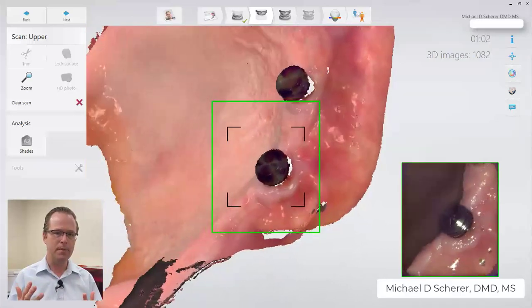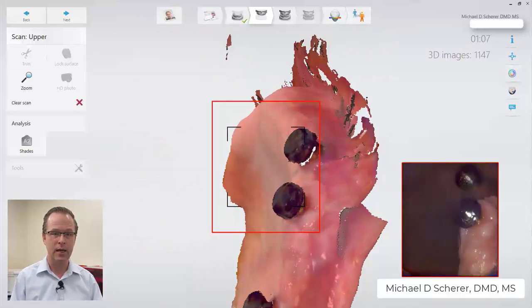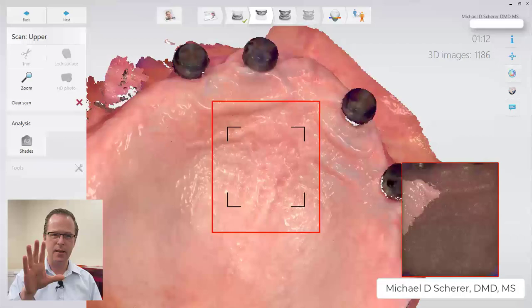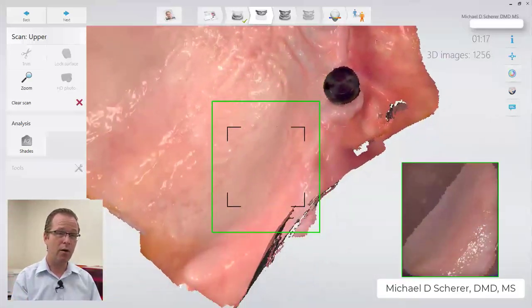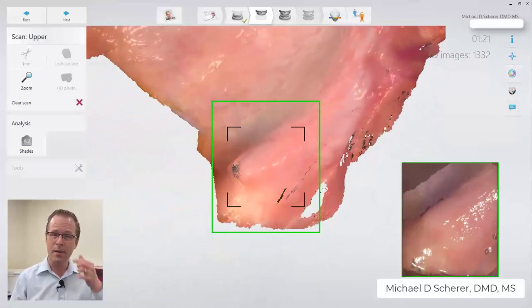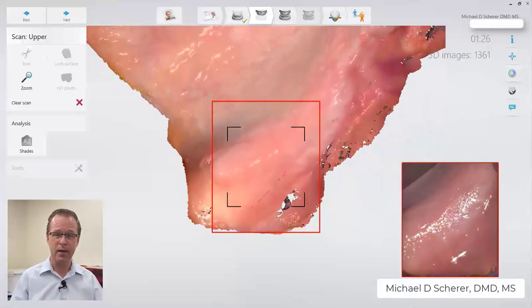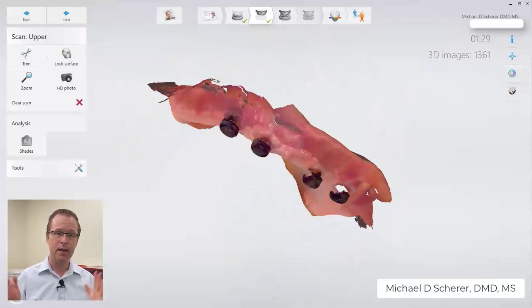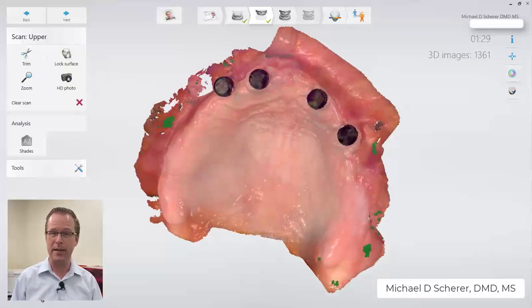We've now captured pretty much everything of the edentulous ridge and the vestibular area in the anterior. I'm going to go back and touch up, and if I ever get lost I go back to the pre-maxilla where I first started. Then I'll go to the posterior aspect, which is oftentimes one of the more difficult parts to detail and pick up — because I have to shift my hands and move around, which causes the vestibule to move a little bit. Overall, we've done a pretty good job scanning the entire maxillary ridge. Now we can go back in and pick up the details around our actual locator abutment housings.